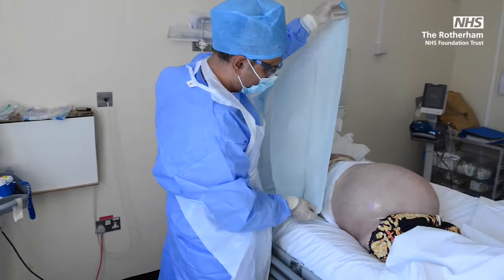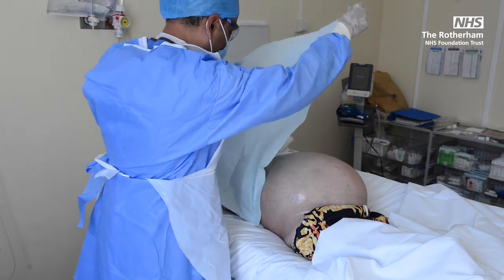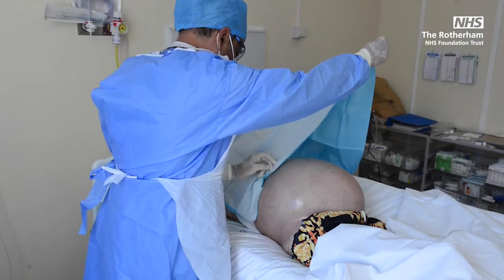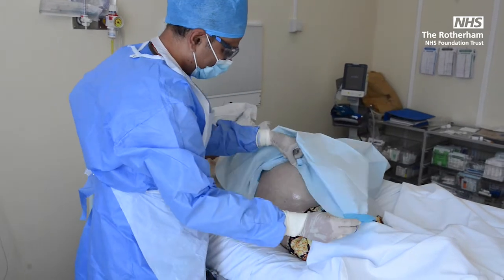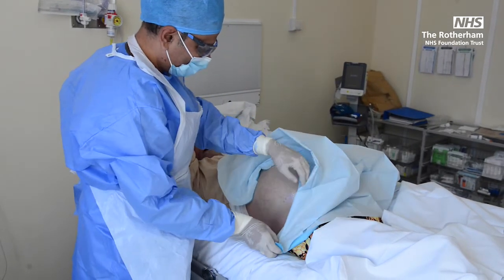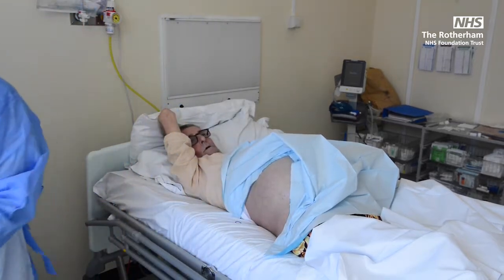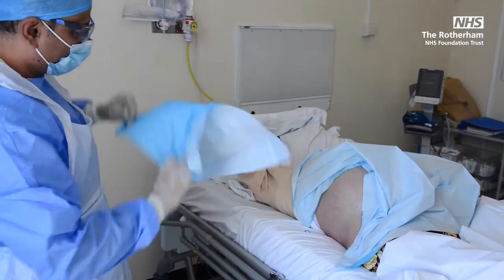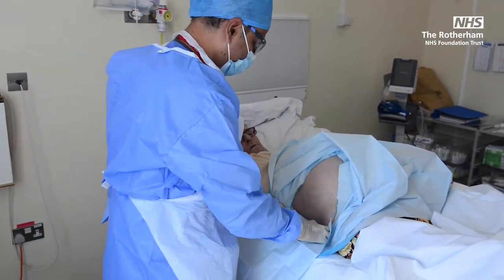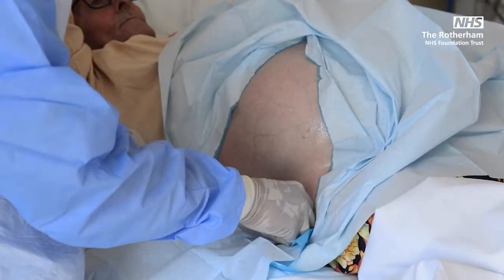Next, I'm going to cover this area and make it completely sterile. So Patrick, I'm just going to cover it around. Don't bring your hands over this. And also with another blue sheet, make sure you cover underneath as well, so you've got a sterile area. Thank you. You don't have to move.